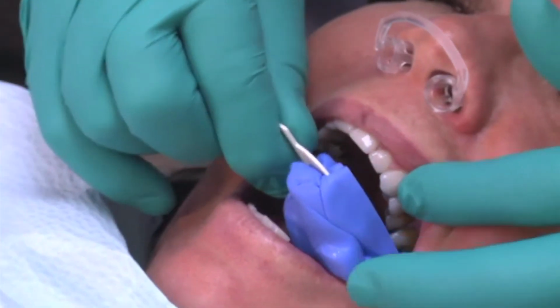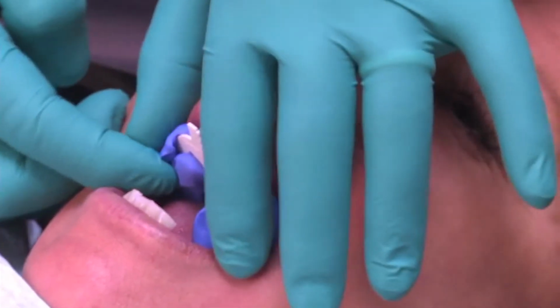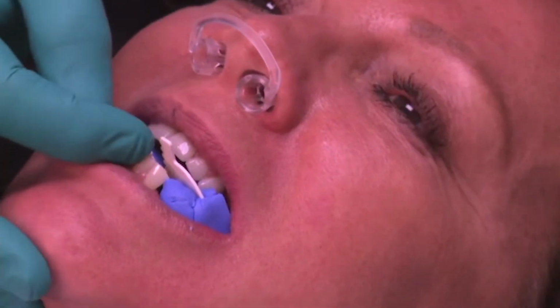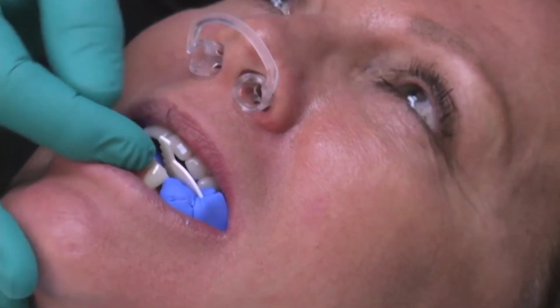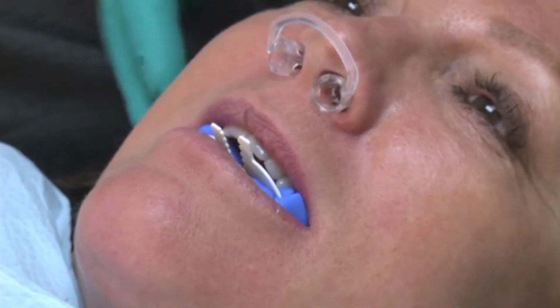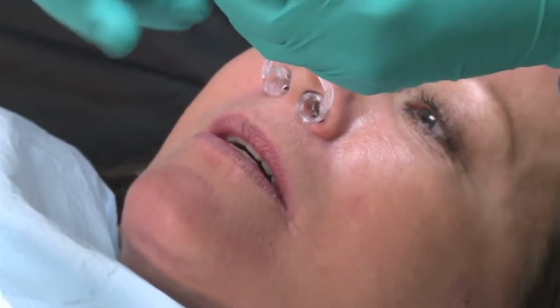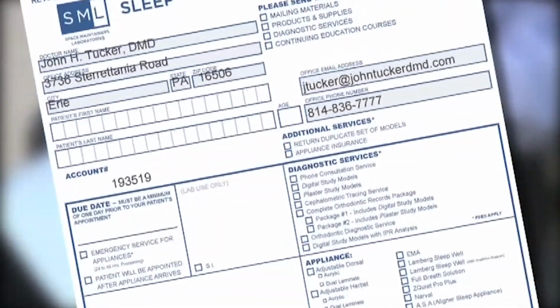All right, so we'll seat our index and close together now, Kim, into that. All right, so we can verify that our midlines are aligned. I like this system because it's easy to see that we have maintained our midlines. Kim, how's that feel? Comfortable, not stressing your jaw joints at all? No. Okay, good. And open. So this will go to the lab with our models and the prescription for our oral appliance.